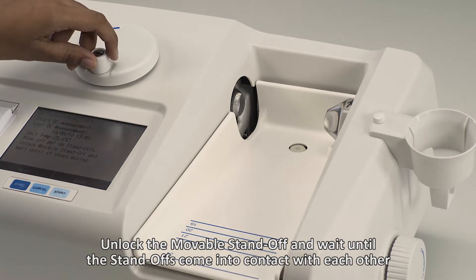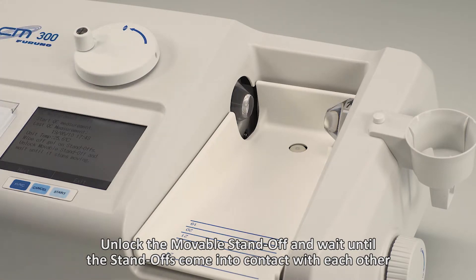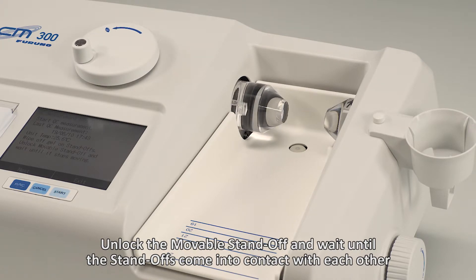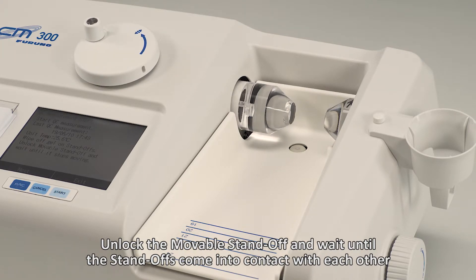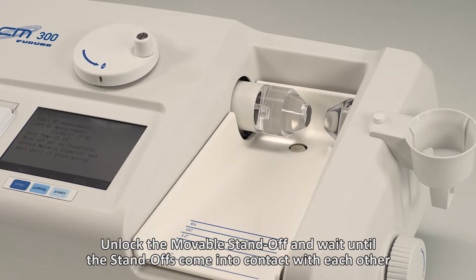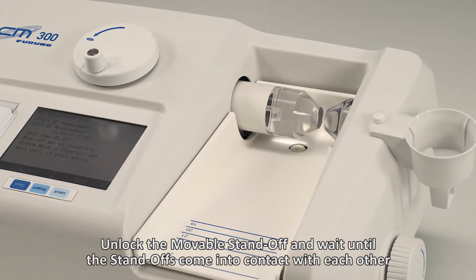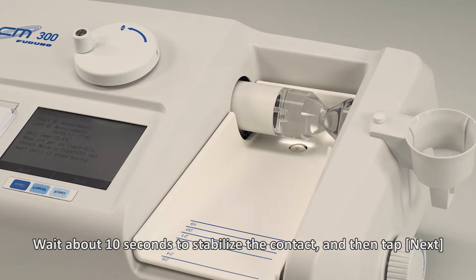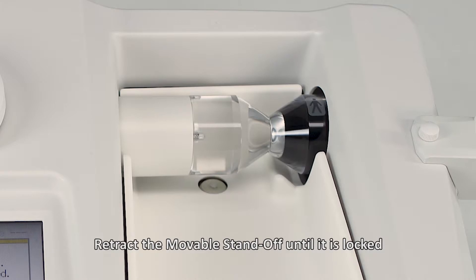Unlock the movable standoff and wait until the standoffs come into contact with each other. Wait about 10 seconds to stabilize the contact and then tap Next. Retract the movable standoff until it is locked.